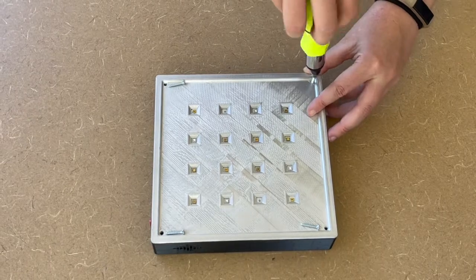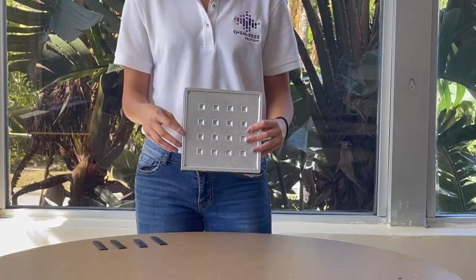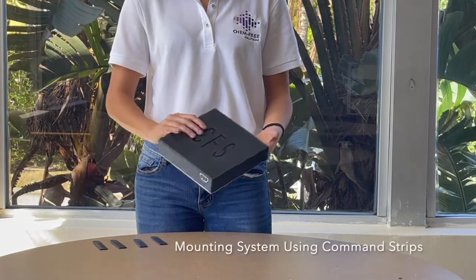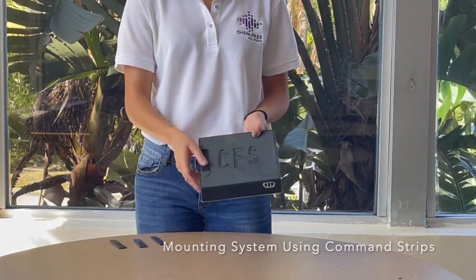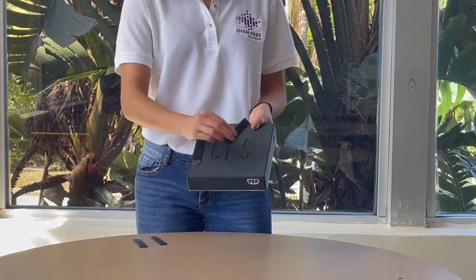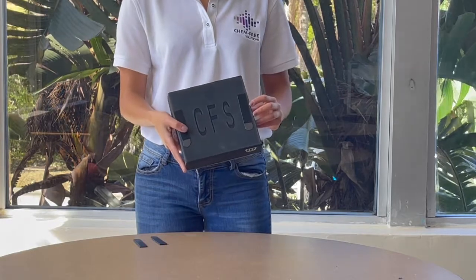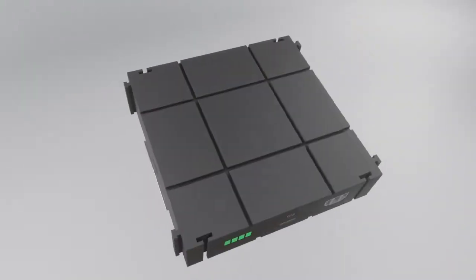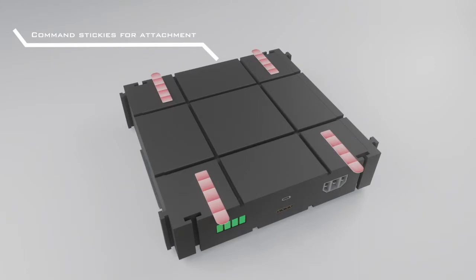Because we want our product to be incredibly versatile and provide a great user experience, we designed it to have an easy mounting system using command strips. This design can be integrated into other systems depending on the use — for example, in personal sterilizing boxes, for at-home uses, for car cleaning at grocery stores, for high-touch devices in hotels, and HVAC systems in airlines and cruises.